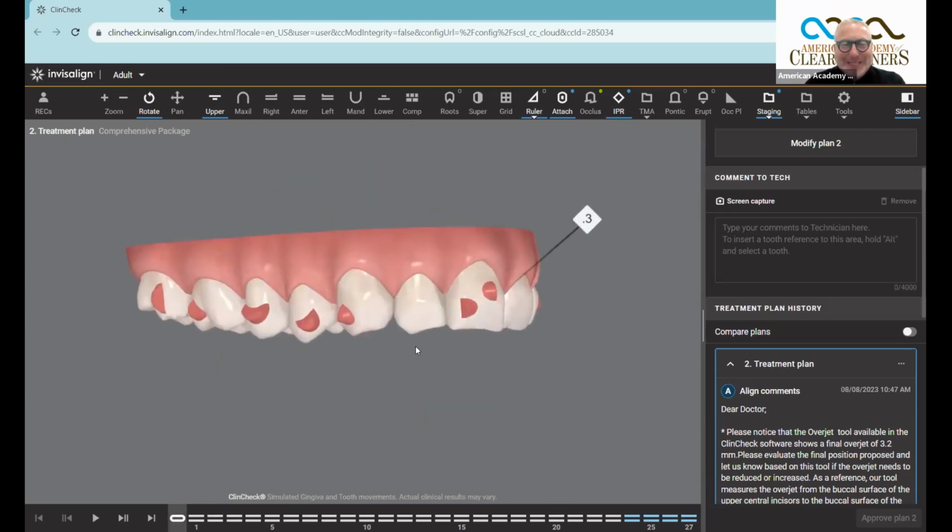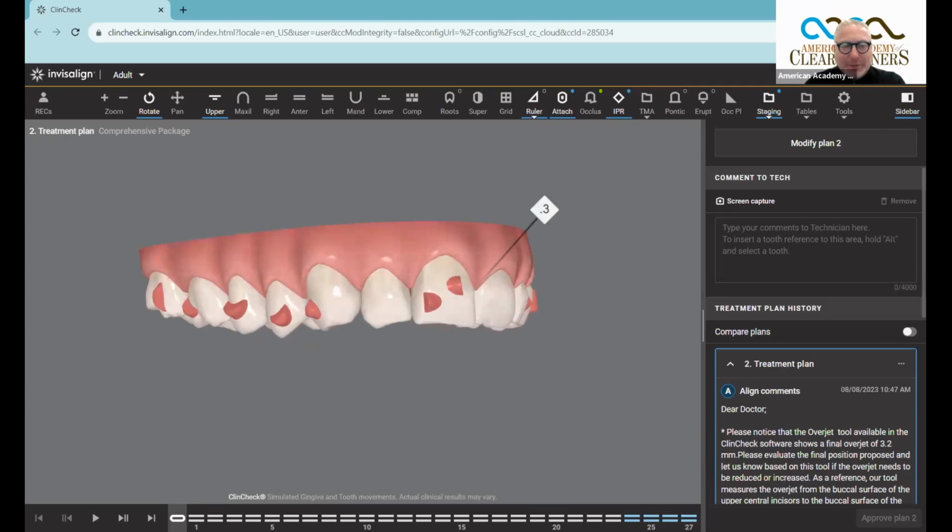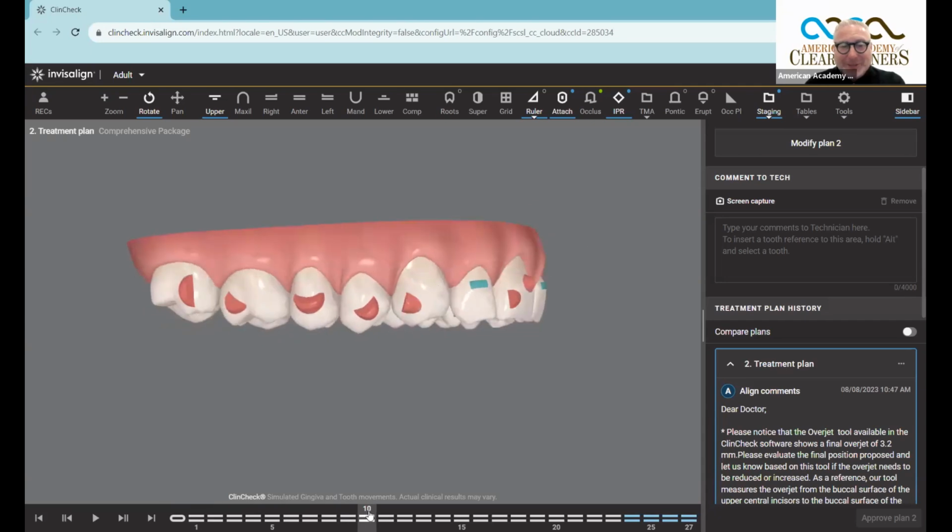But check it out. Look what's happening. Focus your eye on it. So we start out, it's doing some kind of rotation. The root's moving also. Then it picks up a power ridge. It starts doing lingual root torque. Then it picks up an attachment and it starts doing extrusion. And then it pulls all the way in.